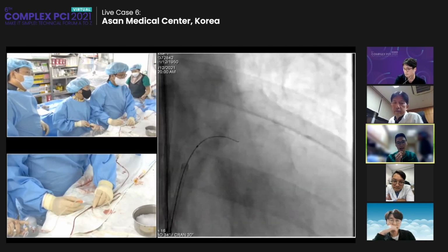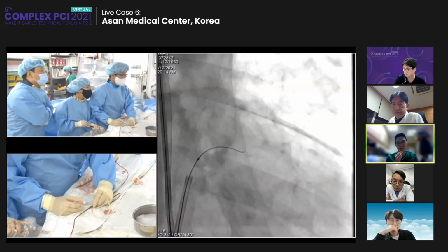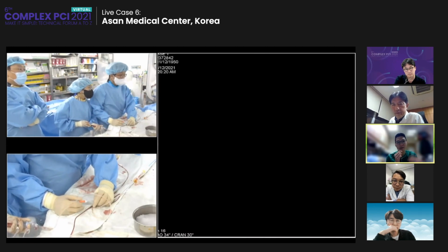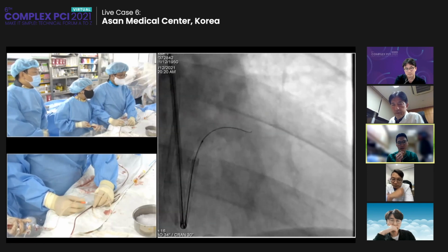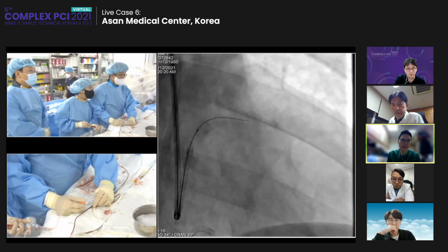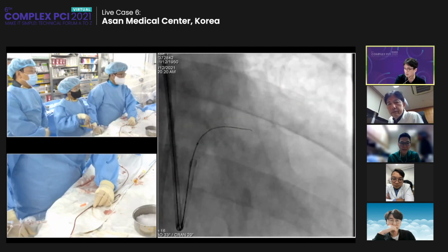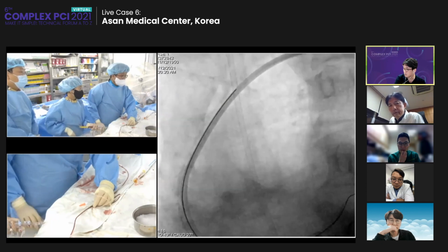And I agree, I will use just a regular microcatheter, but more commonly, I agree with Dr. Muramatsu, we use a torqueable microcatheter just to give you extra support and torque force in case you want to drill inside the occluded body. And then change to a dual lumen catheter in case. Yeah, I agree that the polymer jacket wire in the initial trial would work based on the angio.